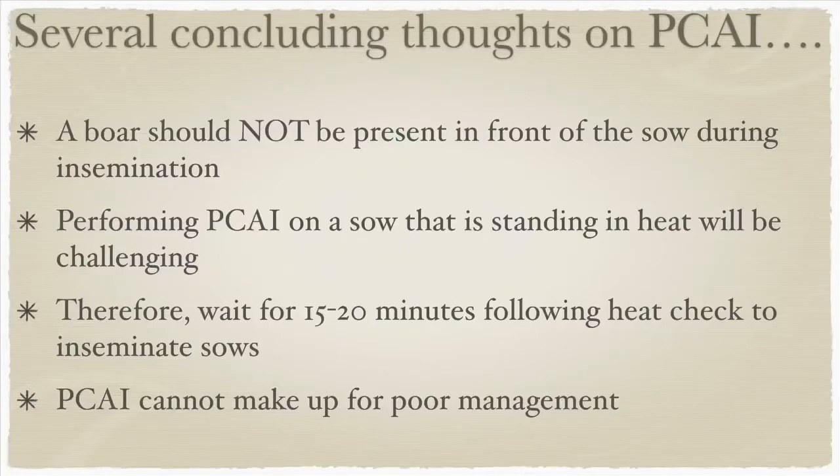For those of you that have performed traditional AI, there are several major differences in the procedures for PCAI. One of the most significant is that a boar should not be present in front of the sow during insemination. In other words, the sow is not demonstrating the standing heat behavior during insemination. Wait a minimum of 15 to 20 minutes following heat check to inseminate the sows.